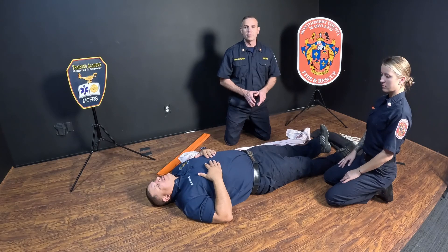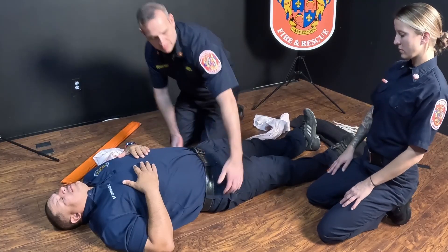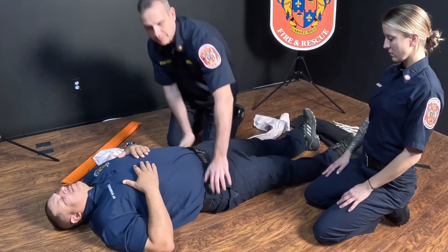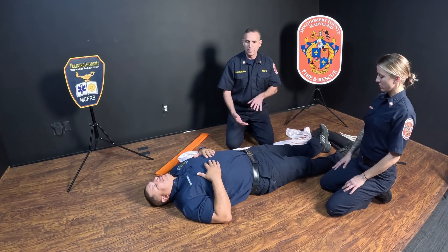For the pelvic fracture, in order to know that we're going to use the pelvic fracture splint instead of the hip splint, we're going to look at our assessment of the pelvis. When we push in on the symphysis pubis, in on the iliac crests, and then down on the iliac crest, if I feel any crepitus or pain response, I'm going to stop the assessment and move on to a pelvic wrap pelvic splint.